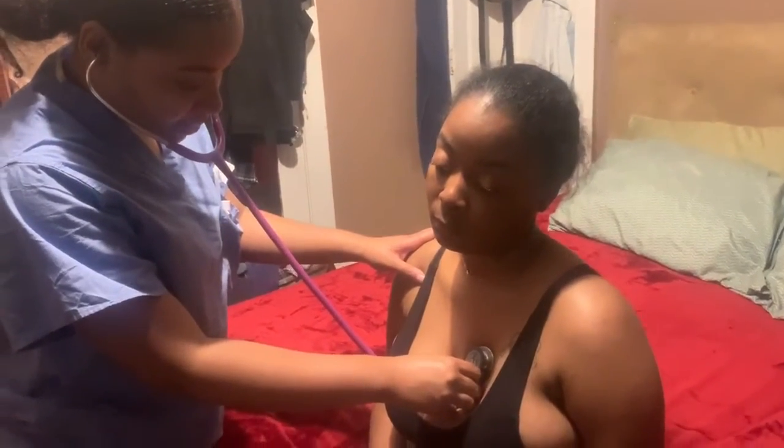Okay, so the lung sounds were clear. I don't note any adventitious sounds, no crackles, no rhonchi, no wheezing heard. So the next thing we're gonna do, we're gonna listen to your heart sounds in the same spots that we pointed out earlier. So we'll use our diaphragm. So we'll start at the second intercostal space, the aortic. Right here, right with the diaphragm. Then move to the second intercostal space, left sternal border, which is the pulmonic. Go here.